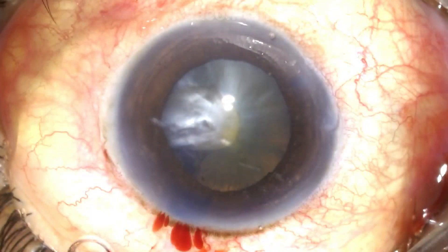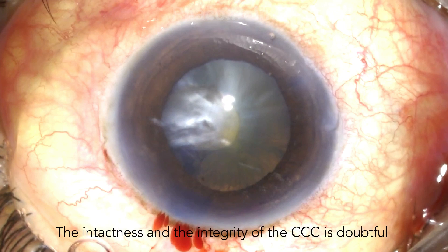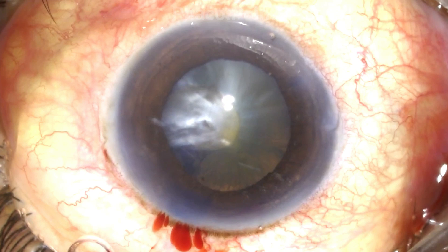I can see the partial capsular rhexis and I can see the point at which the capsular tear has extended deep to the pupillary edge, and I do not know where exactly it lies. At this point, I'm unaware about whether the anterior capsule has extended all the way up to the equator or up to the zonules, or is still salvageable. So one attempts to salvage the rhexis.